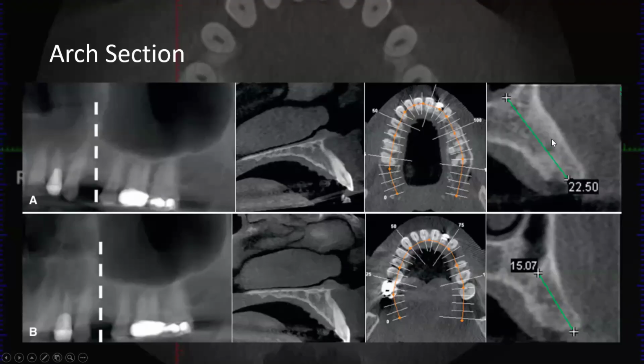That's more than enough. You can sink as long an implant as you want in there. But what do you notice about this? If you haven't changed that orientation to align with the direction of the implant, you're measuring diagonally, and that's going to give you a longer measurement.